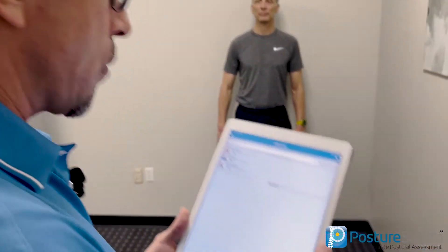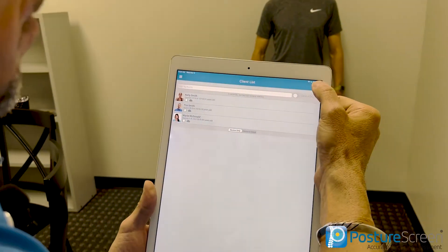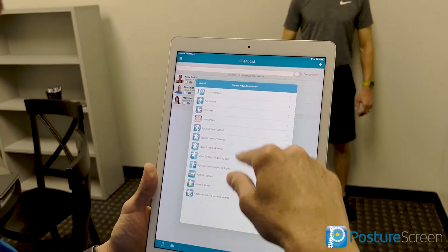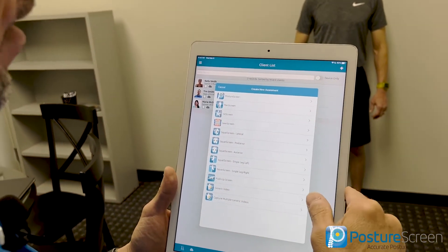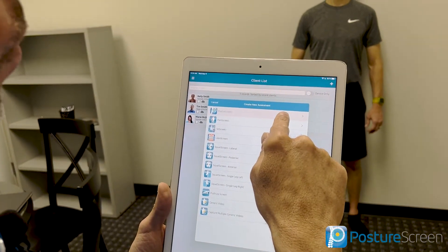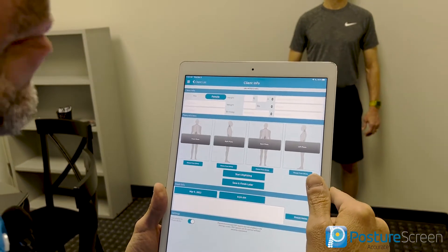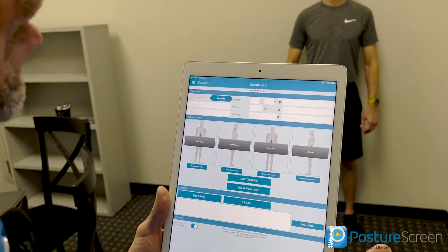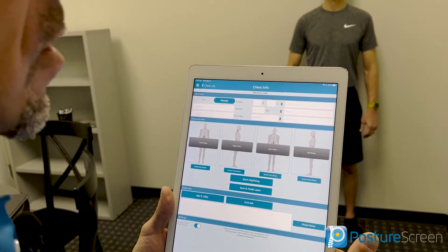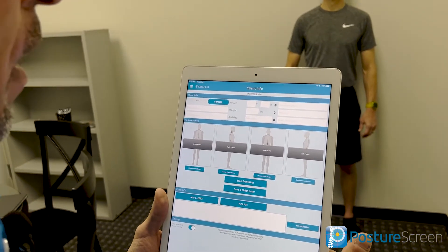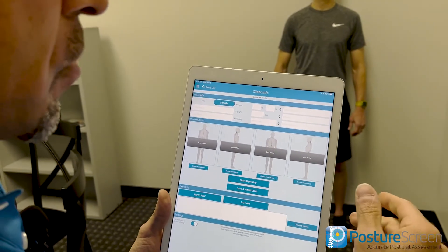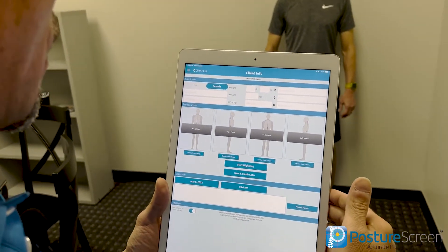So let's check this out. The first thing we do for a Posture Screen is we're going to come up here, click the plus sign, then we're going to select our evaluation and click Posture Screen. I also wanted to remind anyone who's new: the automatic assessments are only part of the unlimited subscription. If you have any questions about that, reach out to support at PostureScreen.com.